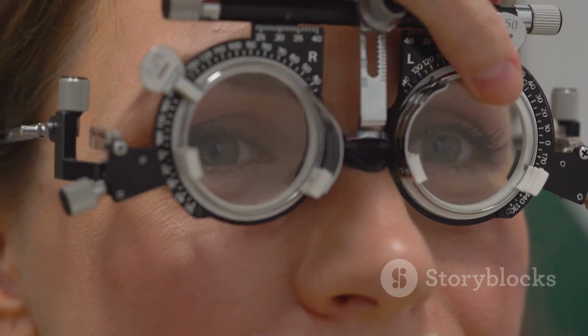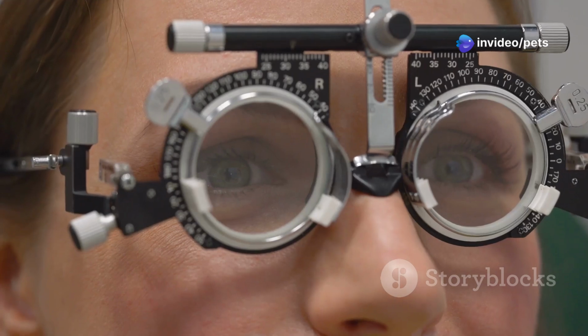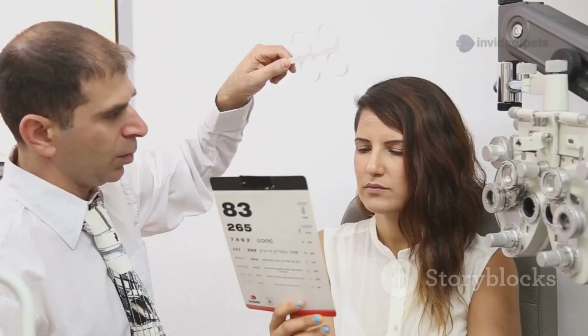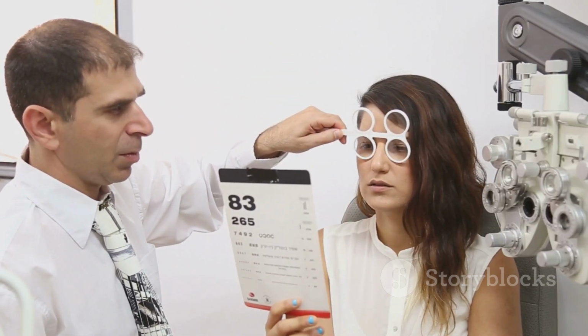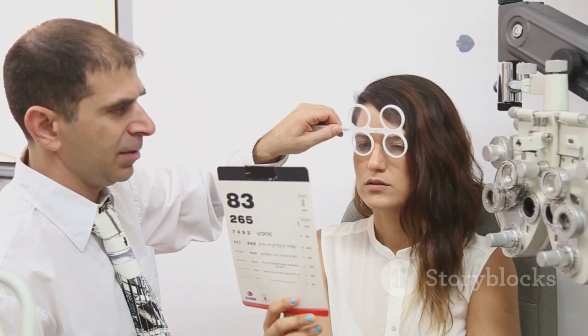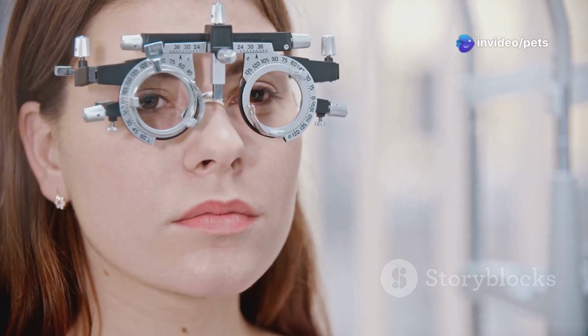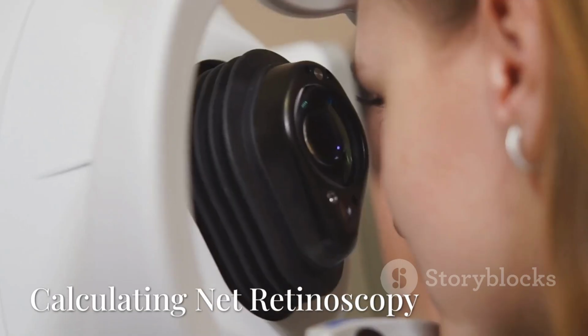For example, if a +2 diopter lens is needed to neutralize the reflex at 67 centimeters, the gross retinoscopy would be recorded as +2. It's important to note that the gross retinoscopy measurement represents the refractive error at the working distance, not at infinity, which is the standard for eyeglass prescriptions. Therefore, further calculations are necessary to determine the final prescription.